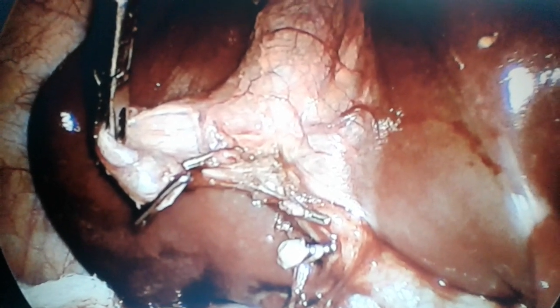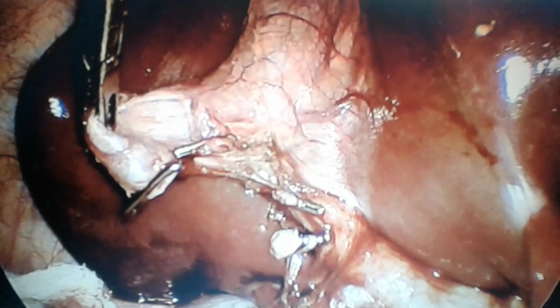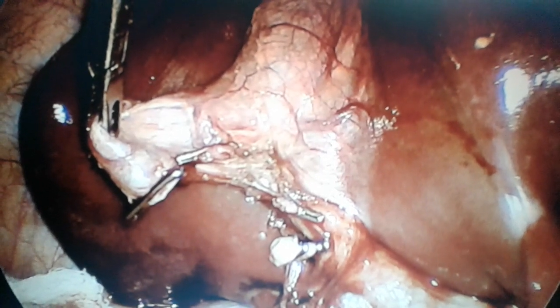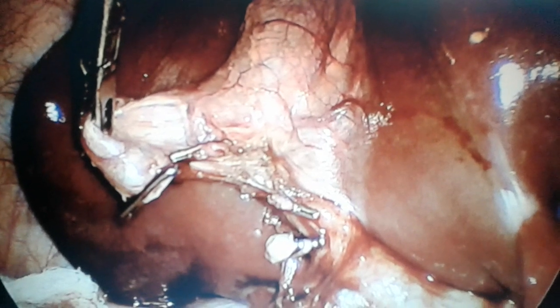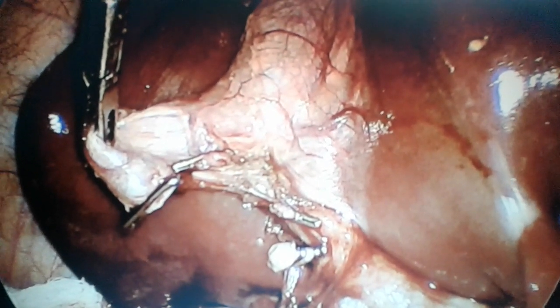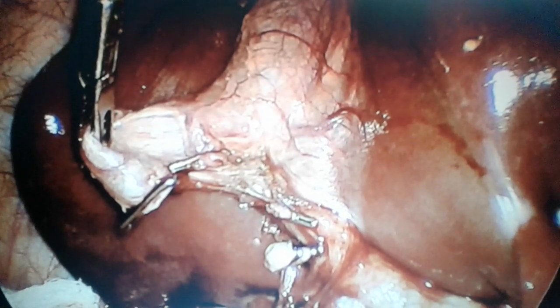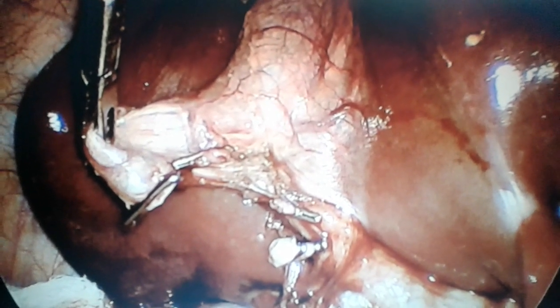Now in this video you can see the cystic duct clipped and cut, cystic artery clipped and cut. Now let's see what are the possible problems during intraoperative period that may arise and then how to manage it.